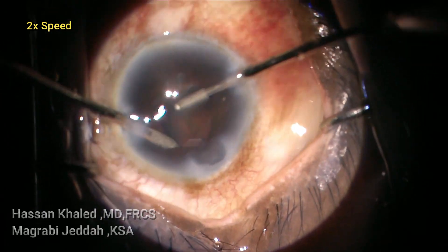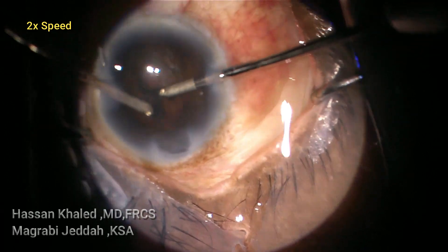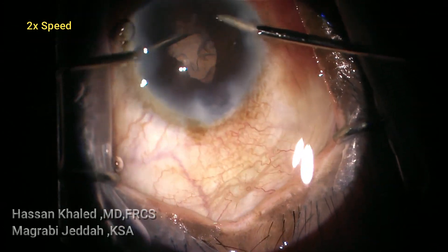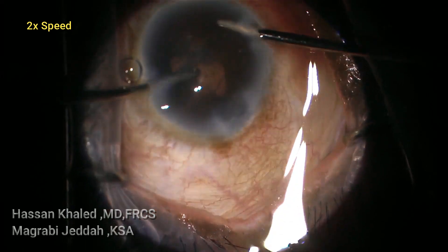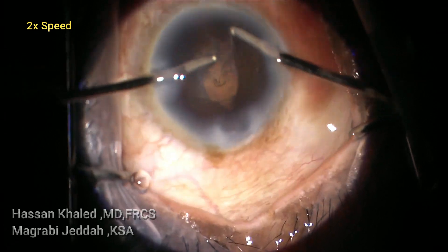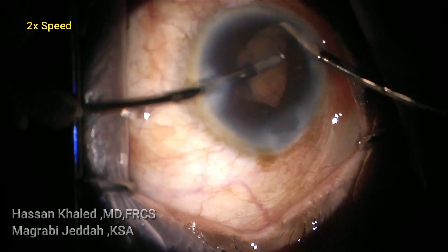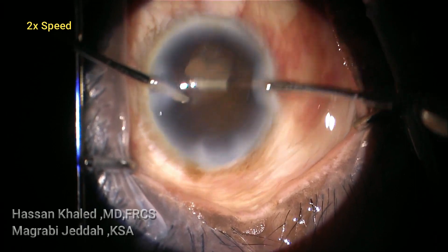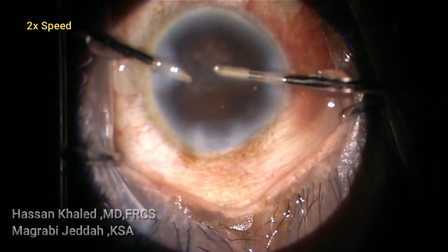Here I'm pushing the iris with the irrigation probe, then using the aspiration probe to hold the cortex and aspirate it. Now you can see the edge of the pupil — it was damaged by the back of the probe inferiorly and nasally.